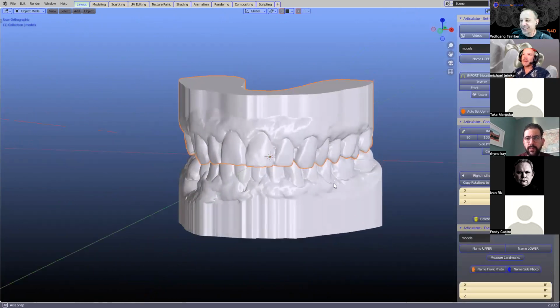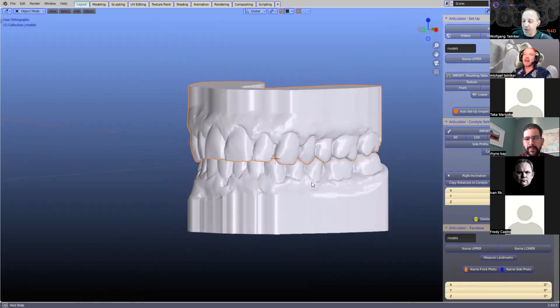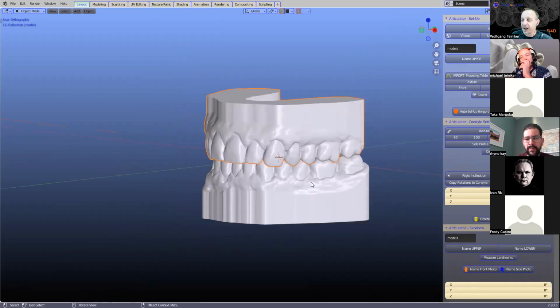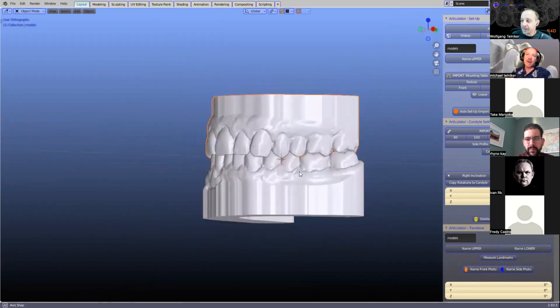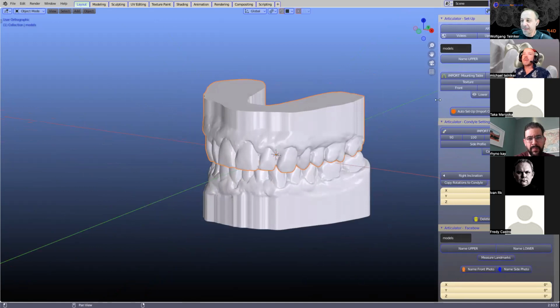Some people never articulate, hey, Michael? Yeah, but in this case, we want to open up your jaw and set it forward. Yeah, digitally, so we always have to align it correctly. We couldn't do that by hand. No. Otherwise, snoring won't stop.